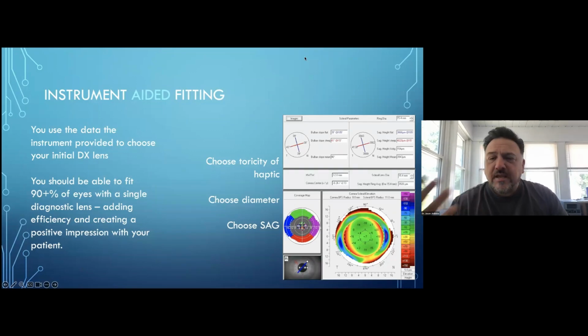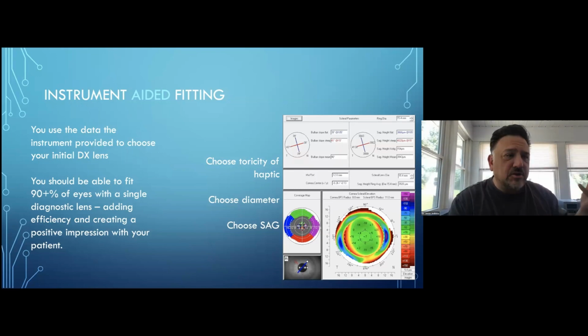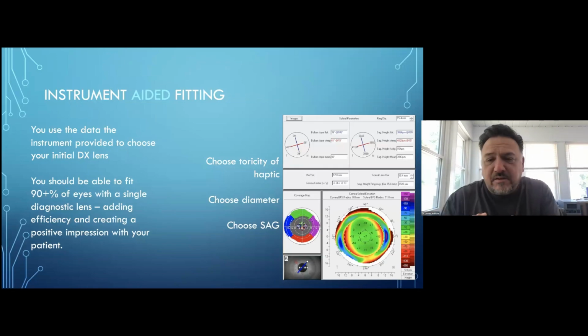So when we talk about instrument-aided fitting, and I will say this, in my practice, I've got instruments. And so I almost never fit truly basically diagnostically, because why would I if I have instruments to aid my fitting process? But that said, I do instrument-aided fitting the vast majority of the time because it's still most cost-effective for my patients. And as long as the eye I'm working on is not too unusually shaped, if I don't have a huge filtering bleb or something on the eye or a tube shunt I'm trying to work around, if I've got essentially a basic, normal, irregular cornea patient eye, most of the time I can get by with diagnostic lens fitting. But if I have an instrument, I'm going to use that to aid my fitting. It would be silly not to.